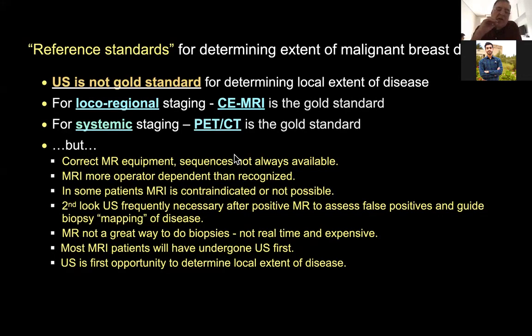So even though we're going to talk about ultrasound for staging today, in the United States, for local regional staging, contrast enhanced MR is considered the gold standard. And for systemic staging, PET-CT is considered the gold standard. But the truth of the matter is the correct MR equipment and sequences are not always available. MR is actually quite a bit more operator dependent than people realize. In some patients, MR is contraindicated, and especially in the United States, some insurance companies won't pay for it, even though we prefer it.